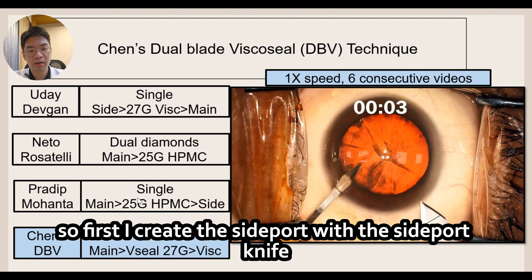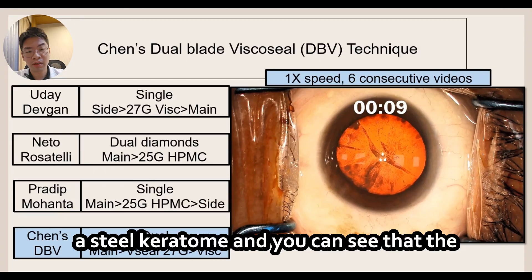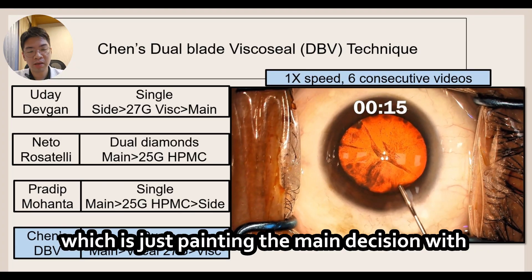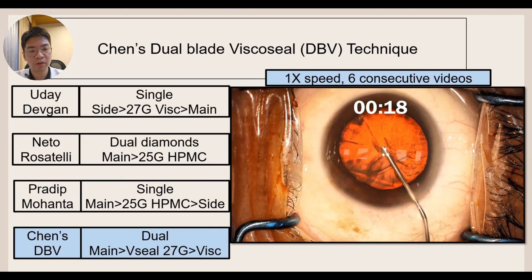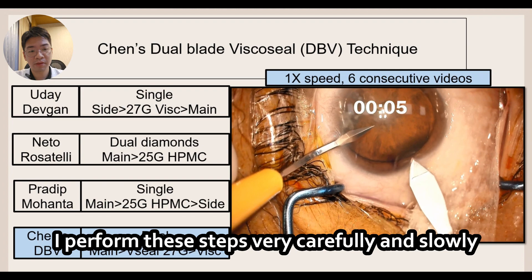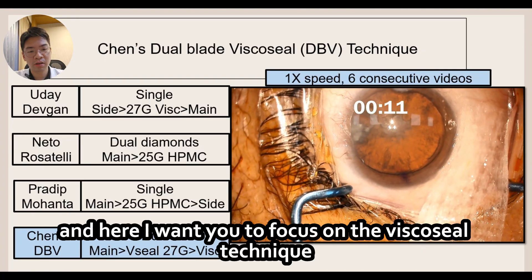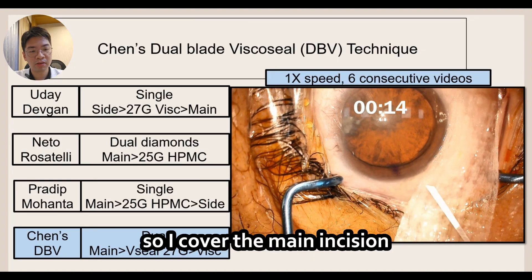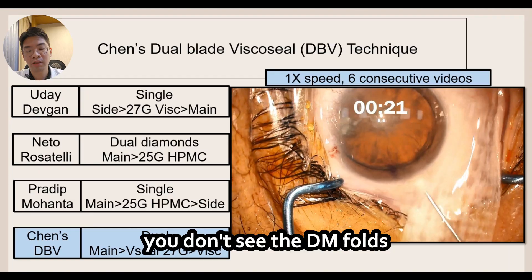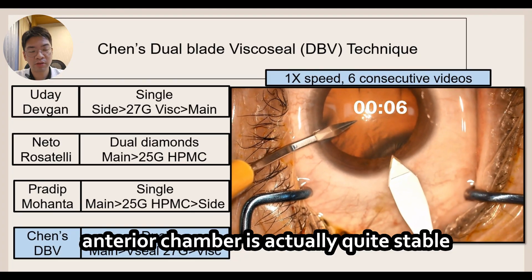First I create the side port with the side port knife, then I create the main incision with a steel keratome. You can see that the angles of the two blades are different. Now I perform the visco seal technique, which is just painting the main incision with visco before entering the eye. I perform these steps very carefully and slowly — I'm not in a rush. Focusing on the visco seal technique: I cover the main incision and, as you can see, the aqueous came out but the anterior chamber did not shallow at all. There are no Descemet membrane folds, meaning the anterior chamber is actually quite stable.